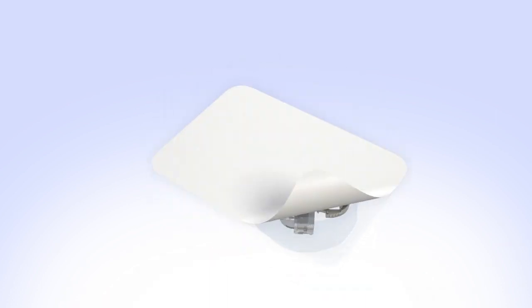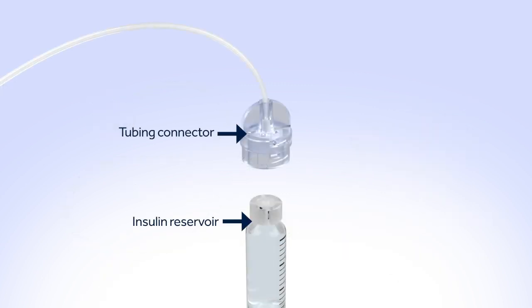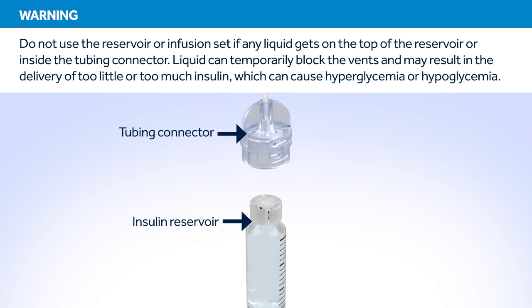Remove the infusion set from the package. Make sure both the top of the reservoir and the inside of the tubing connector are dry before connecting them. Liquid can temporarily block the vents on the tubing connector. If any liquid has gotten on the top of the reservoir or inside the connector, start over again with a new reservoir and set.